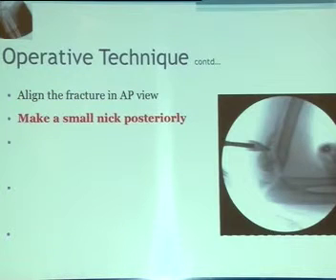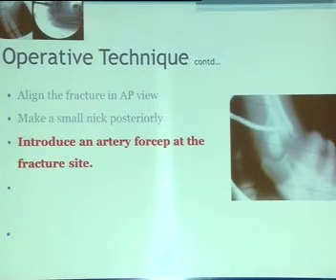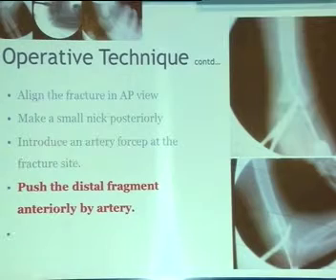Now you see here, make a small nick if you require. Make a small nick, and from here you put an artery forceps, and go from the fracture and go anteriorly to it. So now, see here. You have to manipulate the medial and lateral. You have already reduced in the AP, manipulated it, and then you are putting the artery inside and pushing the distal fragment with the artery, and it goes anteriorly.